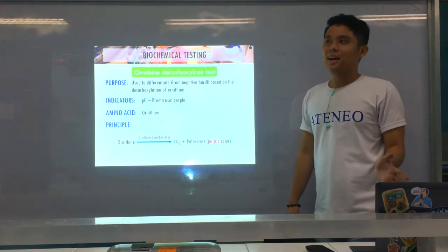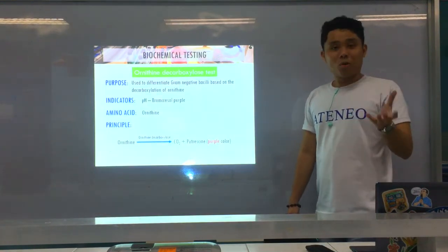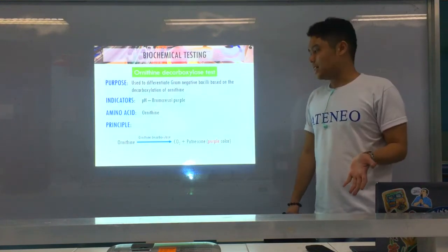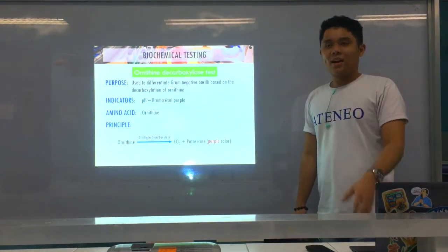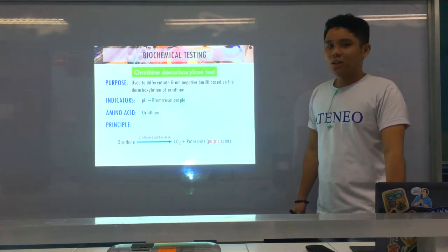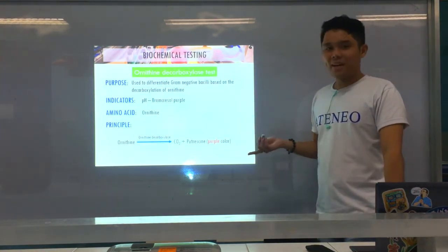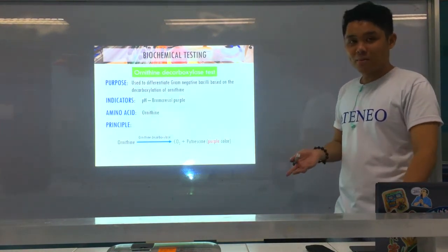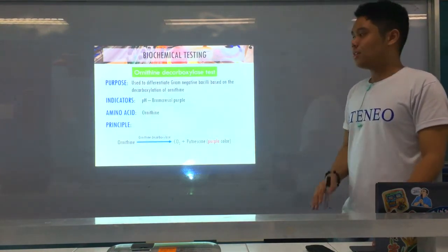Now please take note, guys, kay usahay sa exams or sa boards mo yung na what is the byproduct of ornithine decarboxylation? Putrescine. For lysine, cadaverine. Okay, wala kay ko yung mnemonics ana, I forgot unsa, but I think letters siya ko ato like L, C, O, P, may anar ako. Okay, but again, maybe you will find much more effective mnemonics for your studying, so go lang, laban.